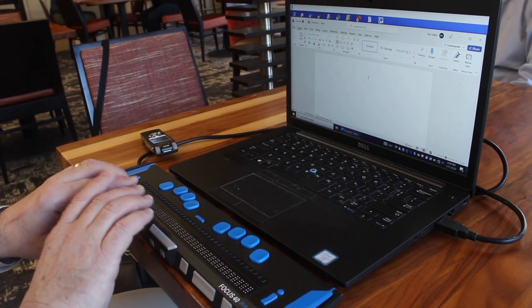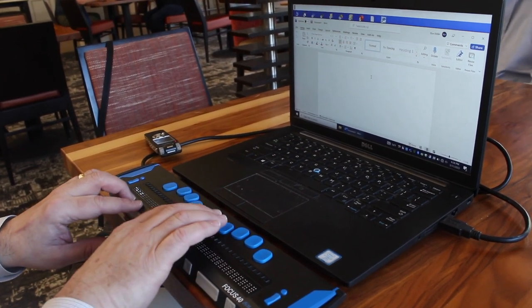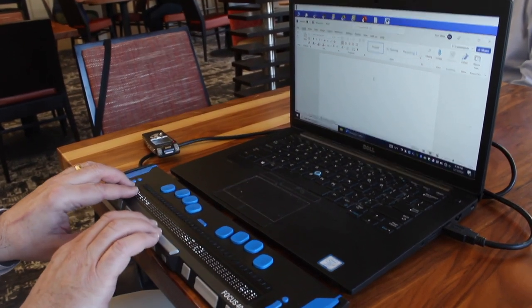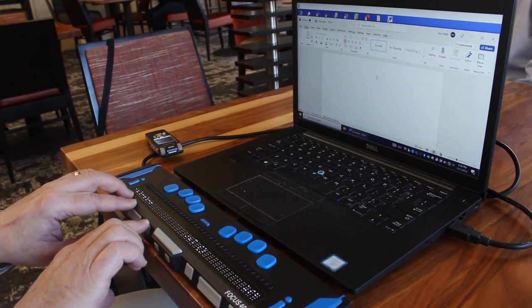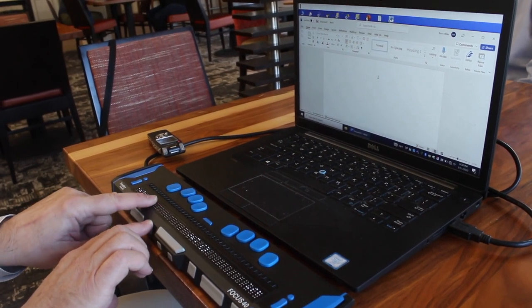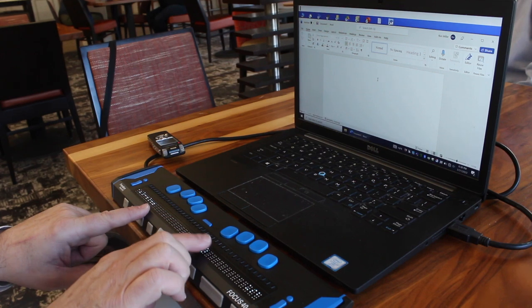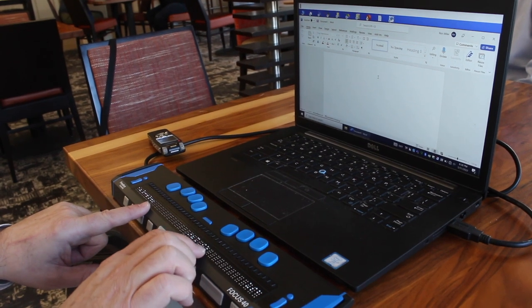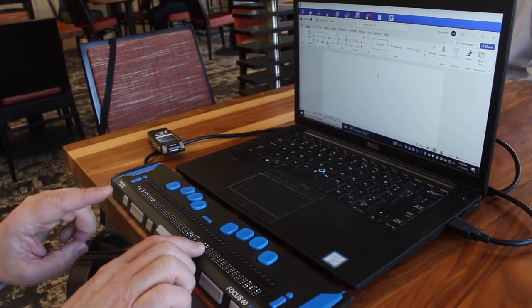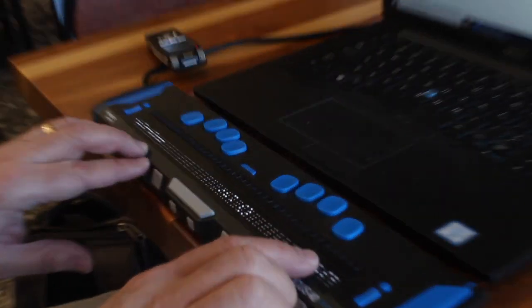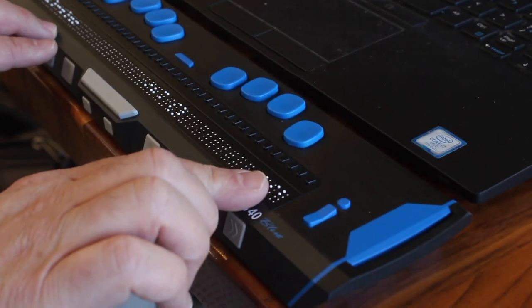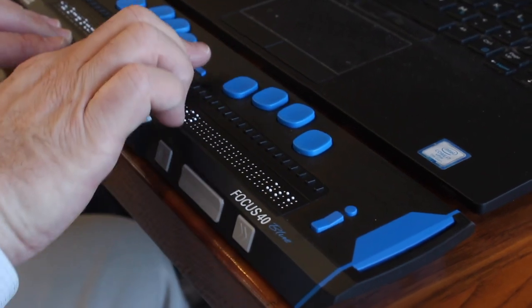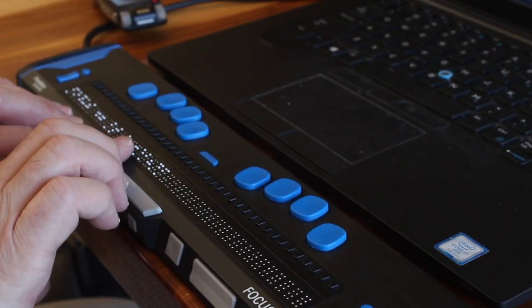I'll have to do it twice because I have an active connection with my PC. You'll notice that the status line has come up, for those of you who can see the display, you've got the clock changing over here on the left, battery percentage here, with a circle indicating the battery's charging because we're connected via USB to the computer. And over here, the letters USB indicating that connection. So because there's an active connection, I'm going to press the menu button one more time.